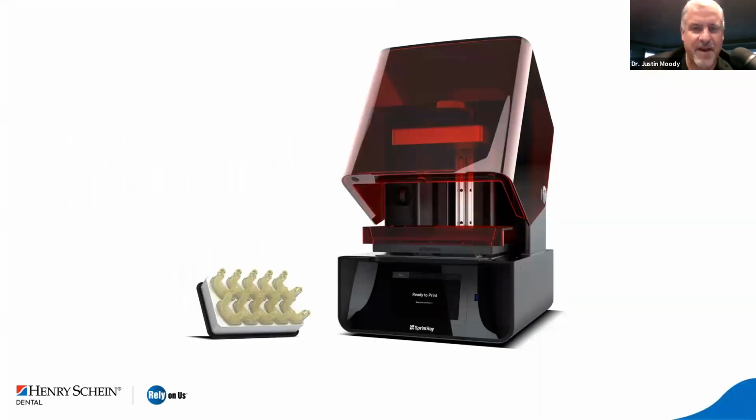So this is the SprintRay Pro. If you take a look at the build plate, here you can see that there's actually 10 surgical guides on this plate. Obviously, we print multiple surgical guides of the same kind like this just because we do them in our hands-ons for our courses. But we can create multiple surgical guides in one print, which is obviously a time-saving process.